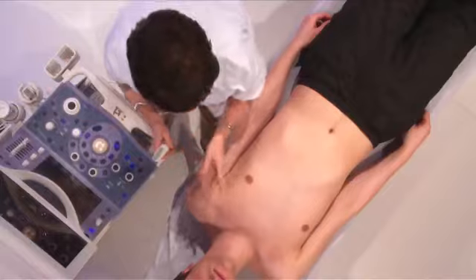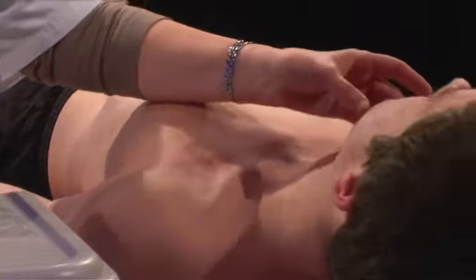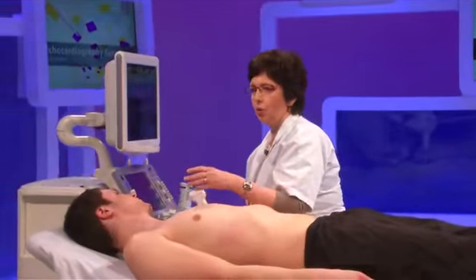I think it's easier to ask your patient to turn his head to the opposite side. And it's easier to always begin with the same side. So it's easier to begin with the right side and then the left side, or the opposite if you prefer.